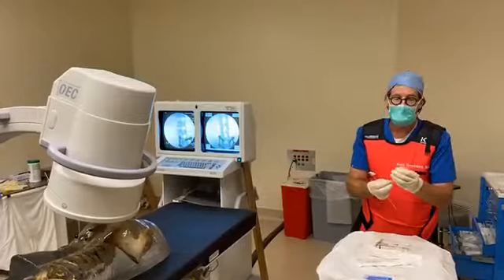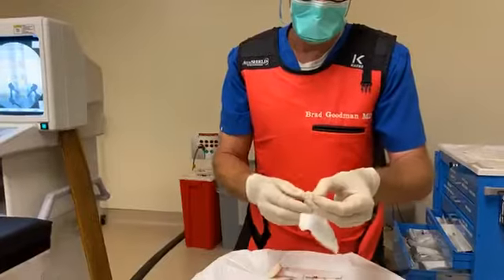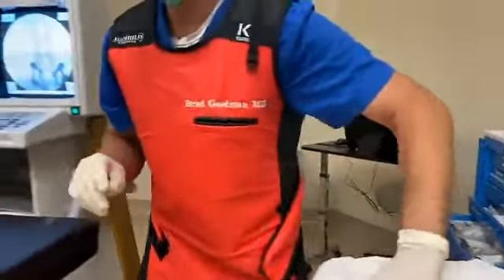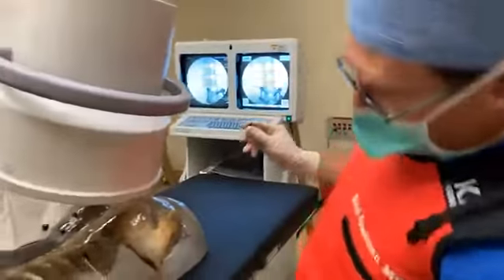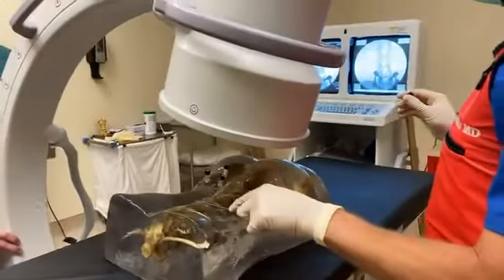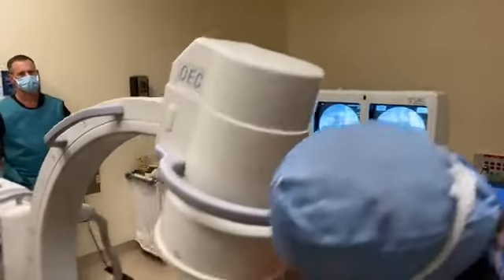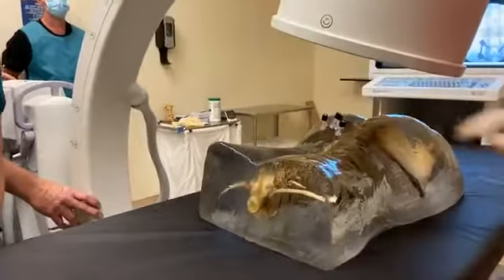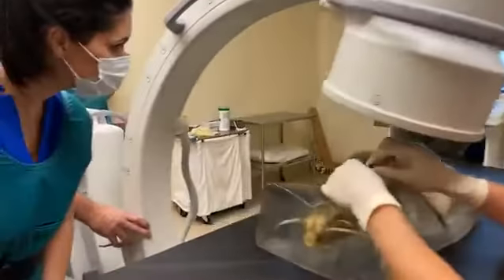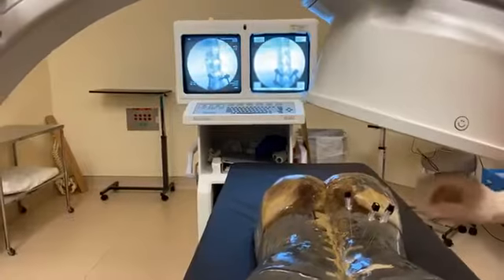We take our needle. We like to put a little bend on the needle. It gives us a level of control. So we put a little bend. Okay. So this is called the pedicle. Right there is the pedicle, and that is the same target we will have for a kyphoplasty or a vertebroplasty. So I'm going to put the needle down on that bone, right into that eye.